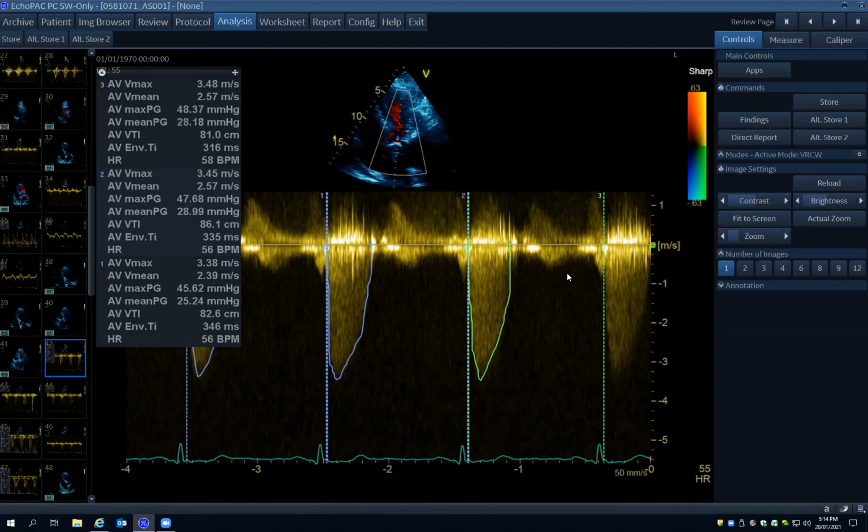Look, I echo all of those points. I think the most important point, no pun intended, is the actual angle and seeing the color flow in the aorta. Once you have that right, I think averaging is always helpful. In atrial fibrillation, you want to do 5 to 7 heartbeats because of the inherent beat variability. I think having a little bit of space just above the baseline to detect regurgitant jets as well is important.